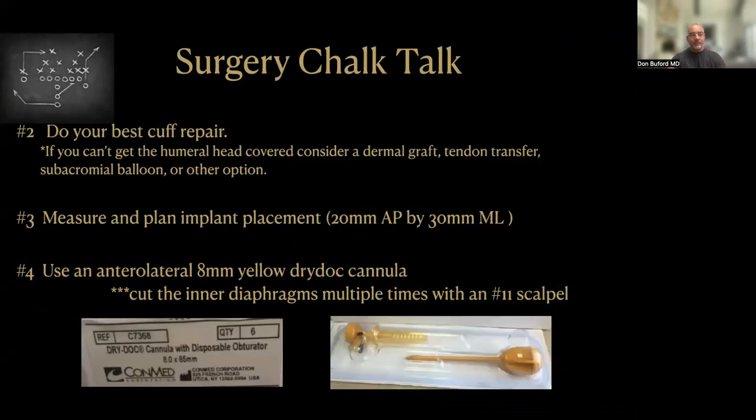The next step is to do your best rotator cuff repair — whether it's lateral decubitus or beach chair position, single row, double row, triple row — whatever your best repair for that patient. One technical pearl: if you can't get the humeral head covered by the rotator cuff repair, you've got to consider a dermal graft, tendon transfer, subacromial balloon, or another option. This onlay technique is really best used when, even though it's a large or massive tear, we're able to get the tendon re-approximated back to the bone. I use an 8-millimeter cannula — in the ConMed portfolio that's a yellow Dry-Doc cannula. When it's time to pass the implant down into the subacromial space, we use an 11-blade scalpel to cut multiple little slices into the inner diaphragms, making graft passage a non-issue.